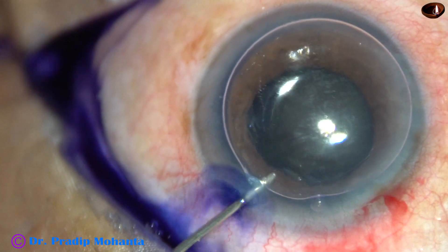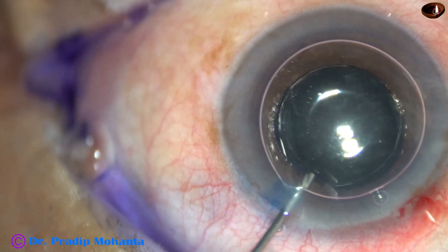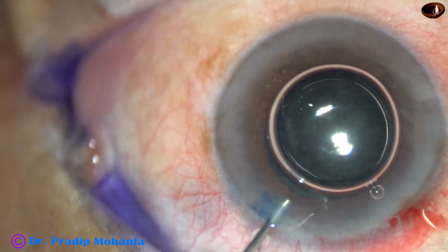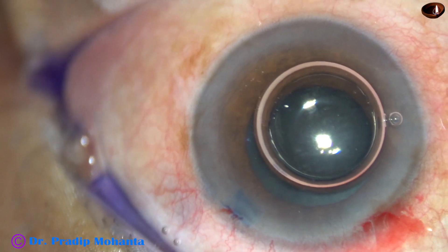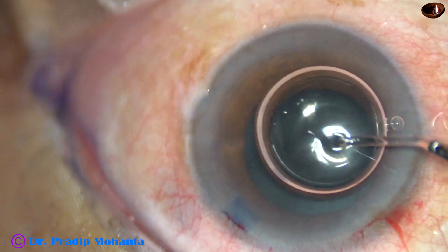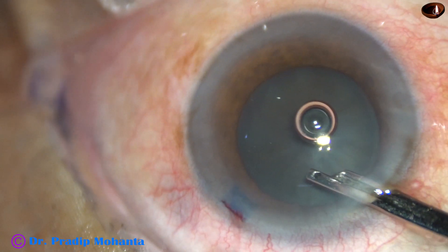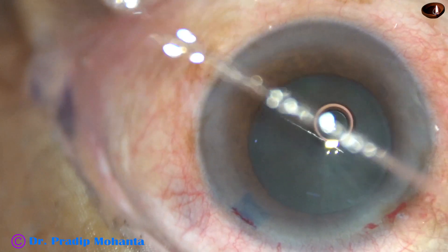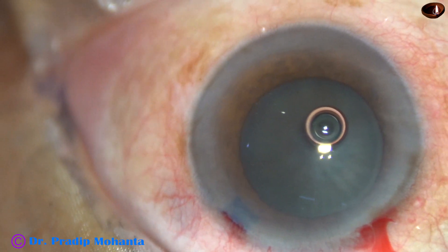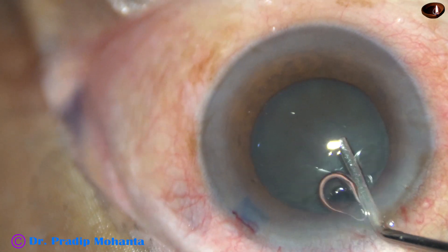This is preservative-free adrenaline to see if the pupil dilates a little more. In this case, the dilatation is adequate at this moment, and if this dilatation remains throughout surgery there will be no problem. You can see white area around the stained area — that much dilatation has occurred because of adrenaline.